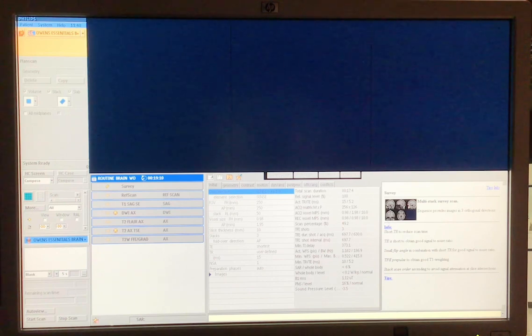So I have not started my scan yet. I only clicked proceed, which downloads it. So if I wanted to right now, I could say, okay, Mary Jo, this first set's going to take about 17 seconds, so just hold real still. Once I click start scan, in the real world, it's going to start with the knocking sound, and it's going to run for 17 seconds, okay?